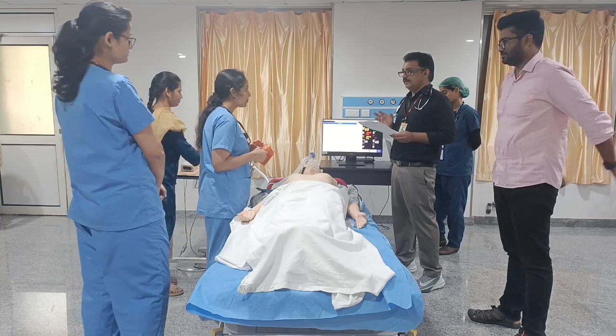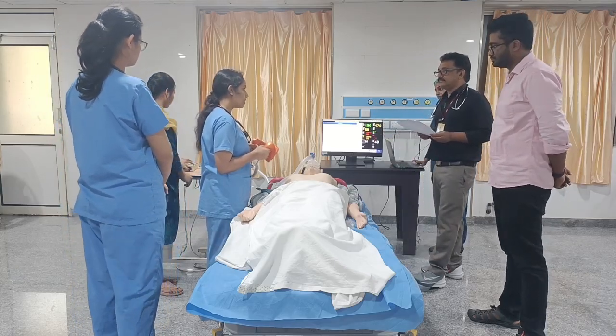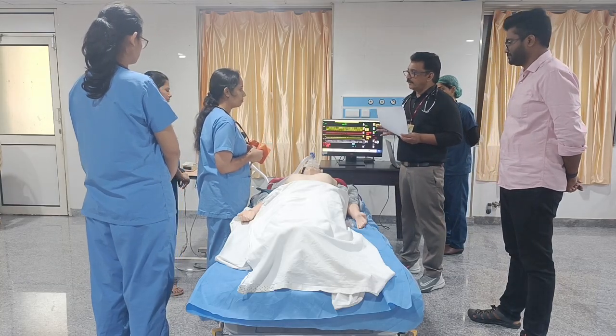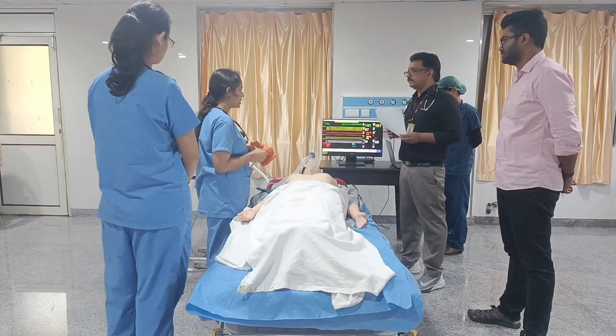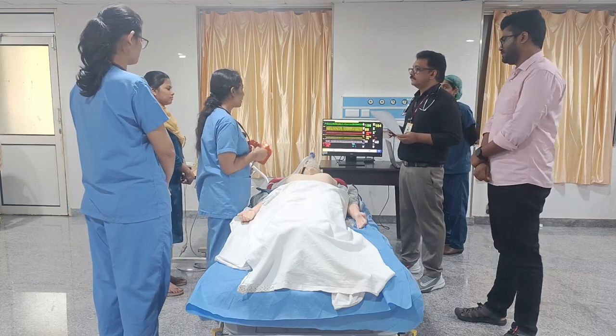Is the patient fully conscious, oriented? Yes. Before giving a cardioversion, we'll have to get the consent of the patient, and since the patient is fully conscious, bystanders have given consent for DC cardioversion. We'll have to explain the cardioversion procedure to the patient, and since it is a painful procedure, we'll have to give the patient sedation.